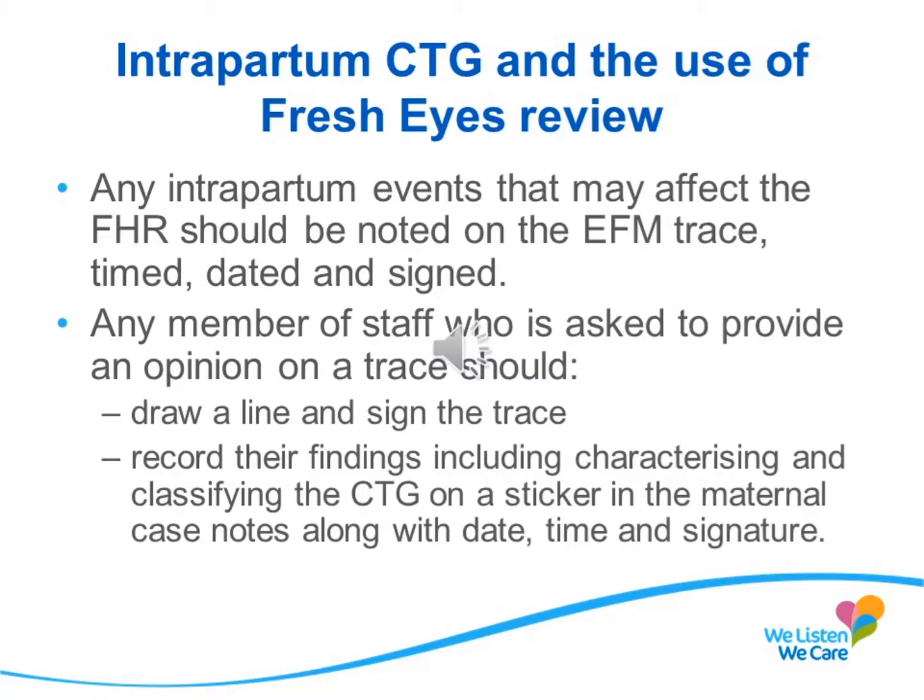They should also record their findings, including characterising and classifying the CTG, on a sticker in the maternal case notes, along with the date, time, their signature, and if they haven't signed the signature log, a printed name and their role. They should also make sure that they've communicated the reason that they've reviewed the CTG and their findings with the woman and documented in the notes that they've done so.